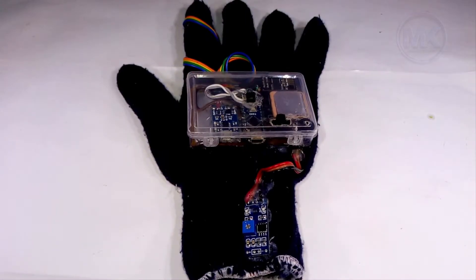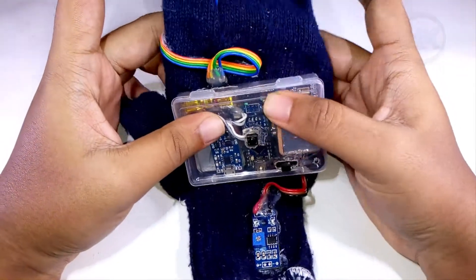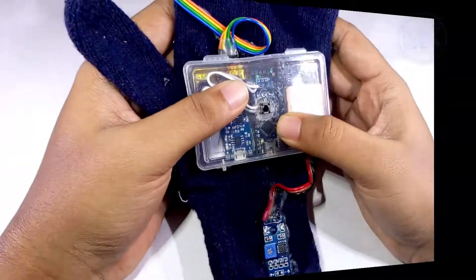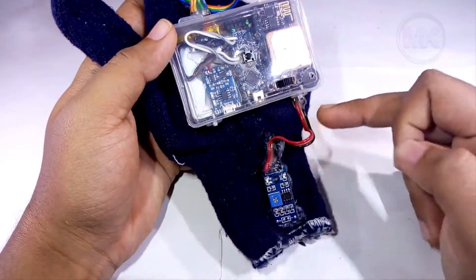Hi guys, in this video I am going to show my new project, which is an IoT-based smart intelligent glove for patient health monitoring. First of all, I would like to explain the components present on this glove.